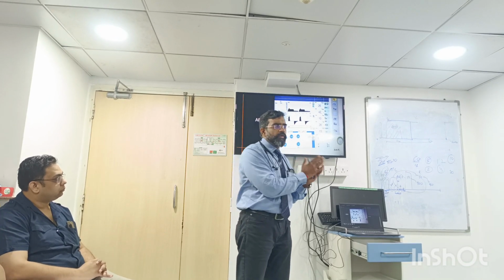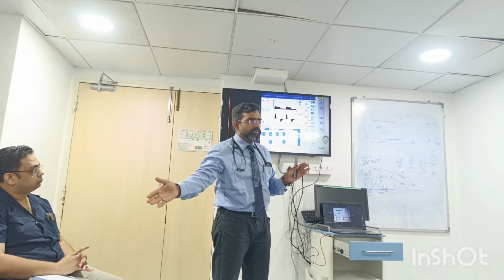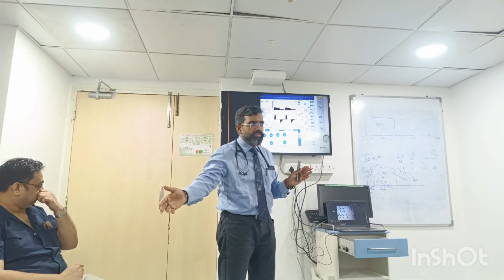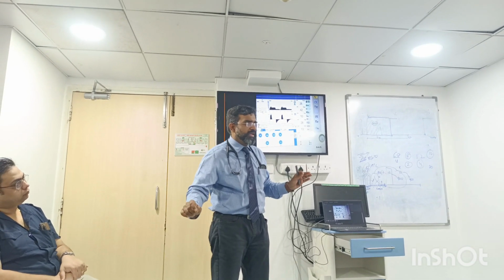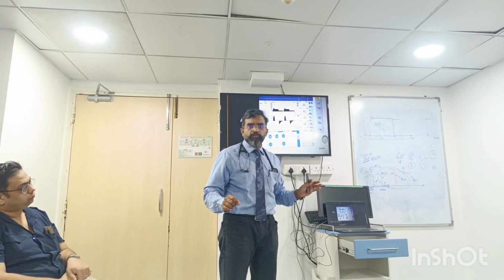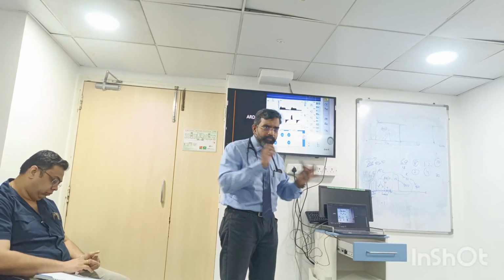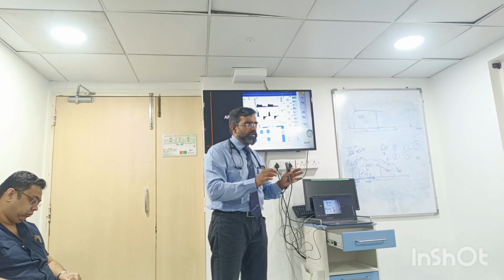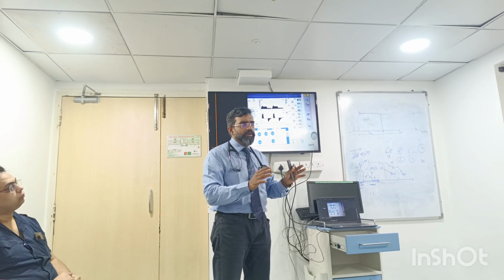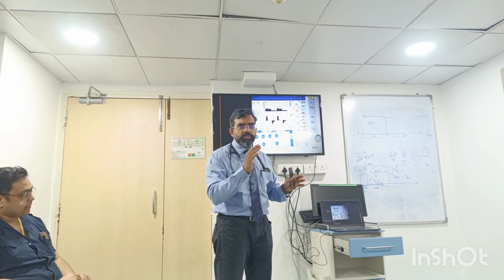So if you have done one change at 6 o'clock, then the next change will be somewhere in the evening, 3 or 4 o'clock, to understand what is happening. You cannot put the ventilator and leave the ventilator. That is wrong, because you will find changes. That is what you are intending to do. Your therapy is going on. It's not just ventilating a patient, you are doing a therapy. That is why you need to come back and interrogate the ventilator again to understand, okay, this is what is happening now. This is what I need to do.